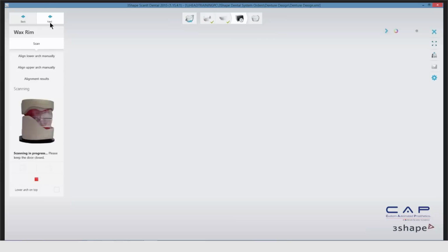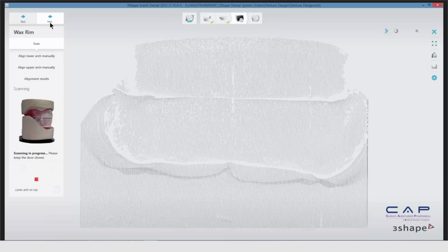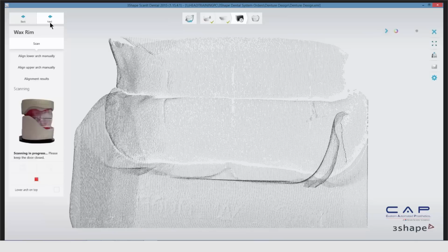Okay, so there's two different systems we're looking at here. So within 3Shape, if the bite was off on your original printed dentures and the dentist changes that, you can just rescan the vertical and then go ahead and move your teeth accordingly to accommodate the new vertical. And if you want, you could go to a second set of printed dentures, or you could go to a final denture on that situation.